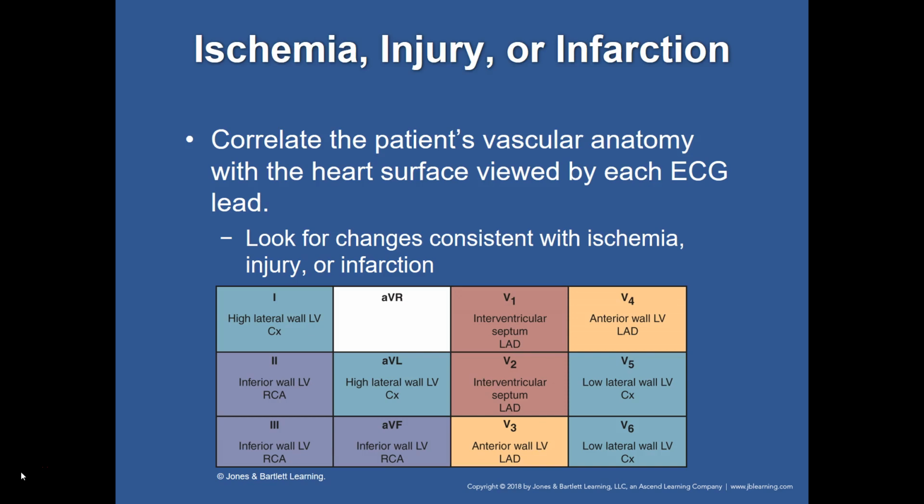When you guys come in the lab, remind me, and I'm going to hand you some cards that look just like this. What this shows you is what each lead is looking at and what portion of the heart it's looking at. This is also where I show you how we can break these 12 leads up so I can help you diagnose whether it's a lateral or inferior, or a septal or anterior MI. And then we'll apply it to a 12 lead in a minute. So what we're going to talk about is this right here.